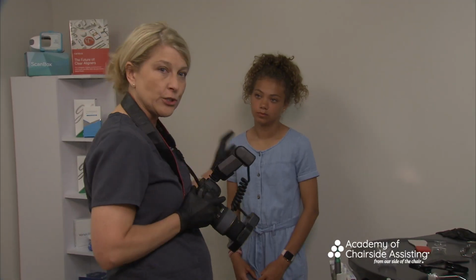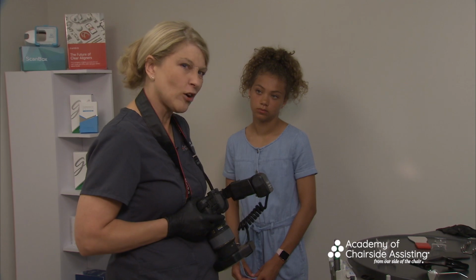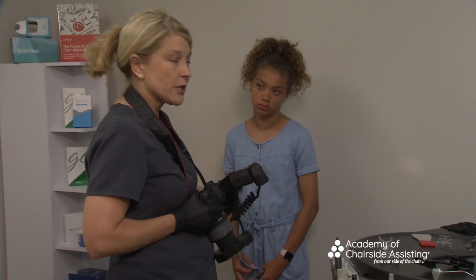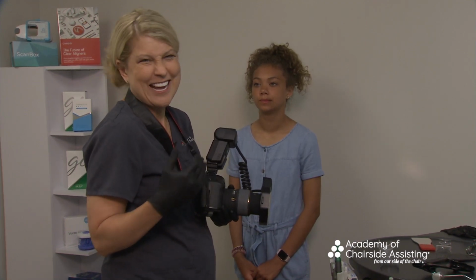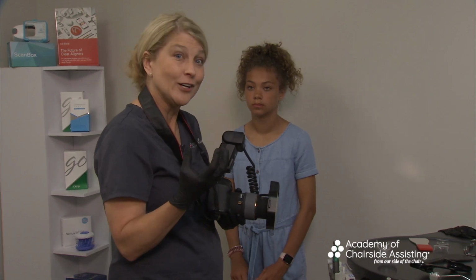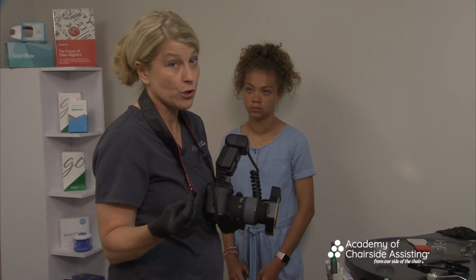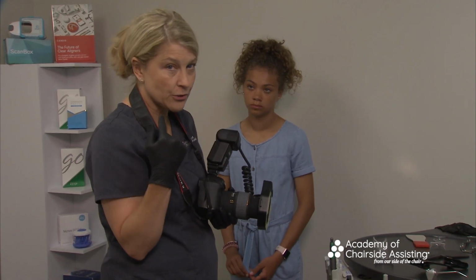The next one that we're going to have Kylie do, because Kylie has a class 3 bite, which means the lower jaw kind of comes up and under, which is why she's going to go through ortho. But what I want you to think about is this, even for elder, I say elder, I'm old myself, but as we get older, we know things start to fall. And when we're doing aesthetics, and we'll talk more about this in the lab portion, the lip will come down and we don't see a lot of tooth structure.